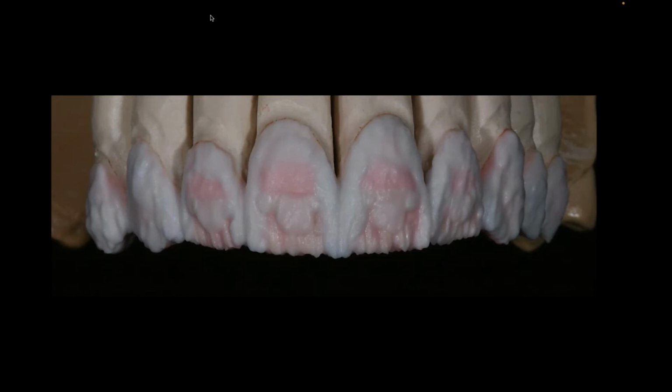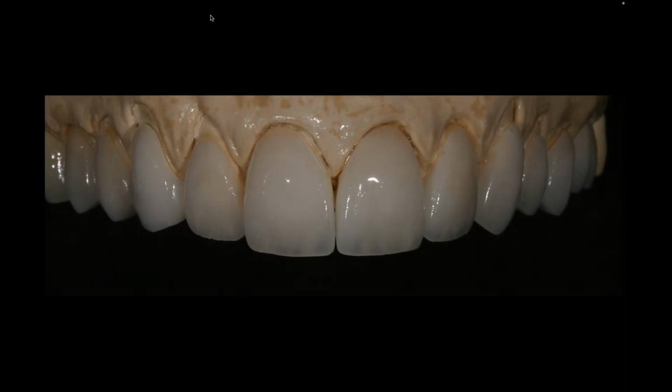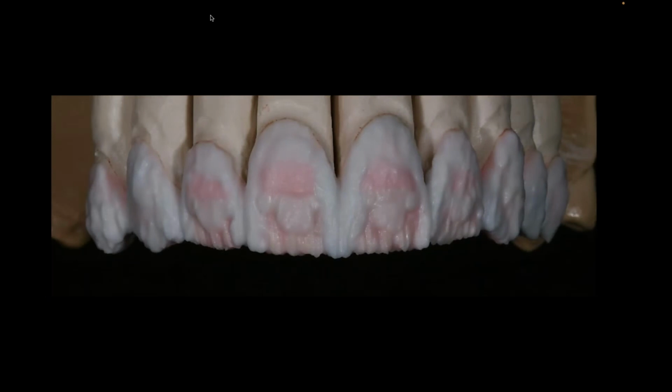But realistically, before I did any of that, my first thought was, what type of enamel should cover that? And notice my shell of enamel over those teeth right now. It's kind of a fairly transparent enamel. So what am I trying to do? I'm trying to allow a lot of light into the tooth and have my dentin, the mamelons, and structure carry the coloration. So let me kind of play that photo for you again so you really get the idea.